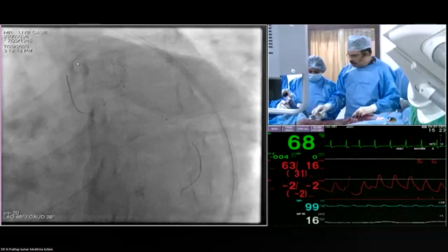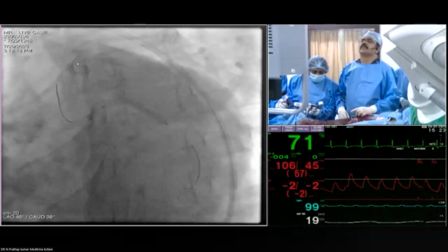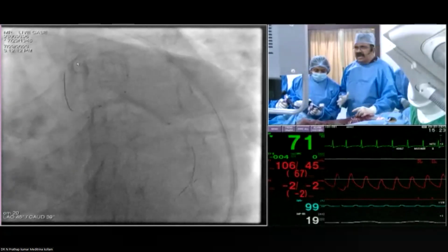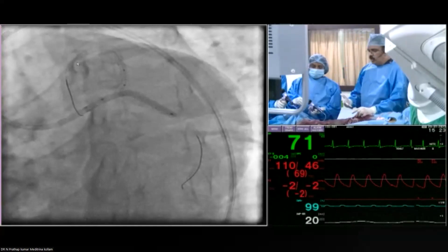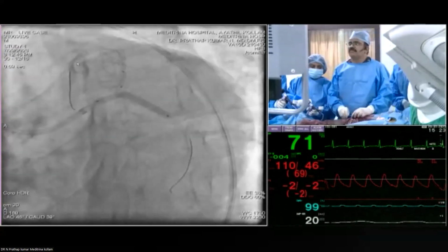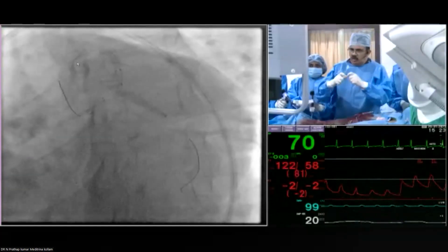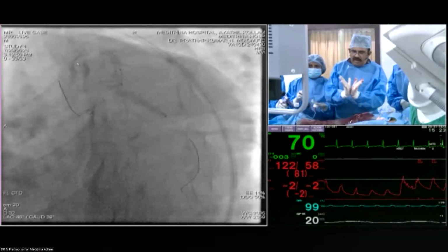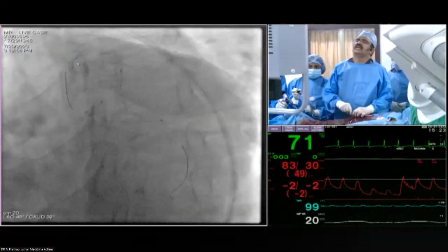No, same stent balloon. That's a bit different from the approach of the Chinese guys. The Chinese guy only does that. Now he is doing a modified DK crush like this. He just does a balloon dilatation so that the ostium of the circ gets well opened up with a high pressure and with the same stent balloon, and then takes the balloon out.